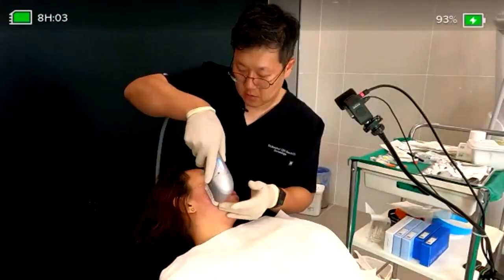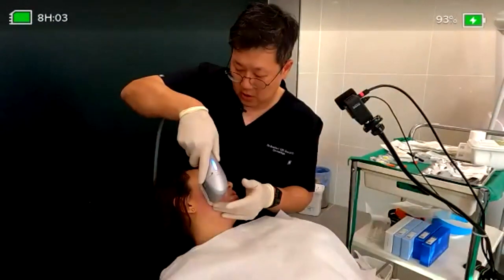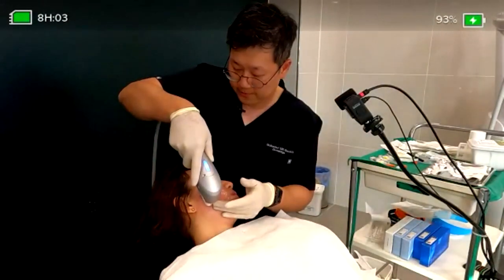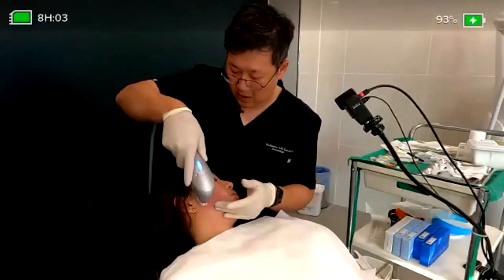Again, the hand pace and the repetition rate is super fast. So usually before the numbing cream wears off, you can just finish the treatment in time.